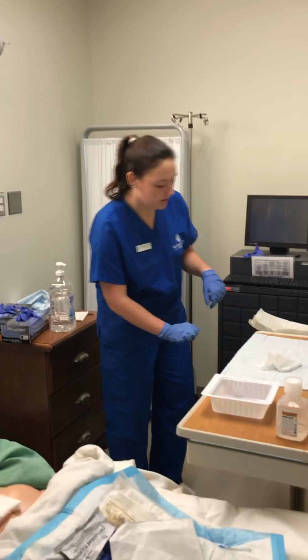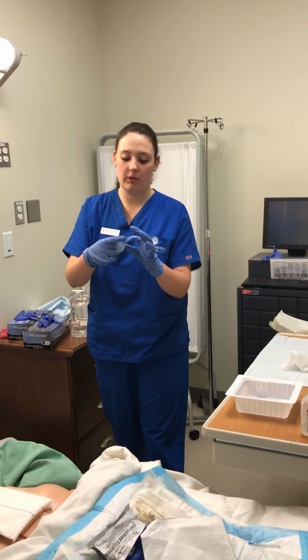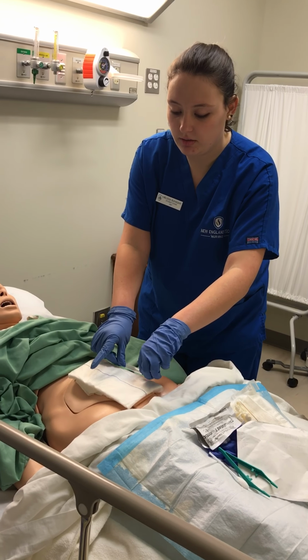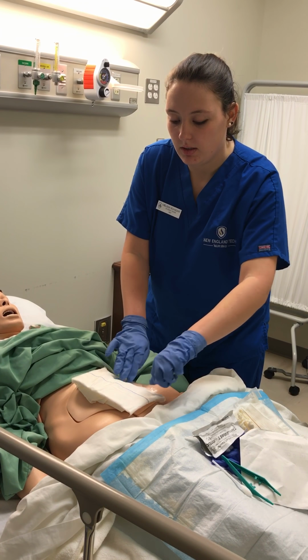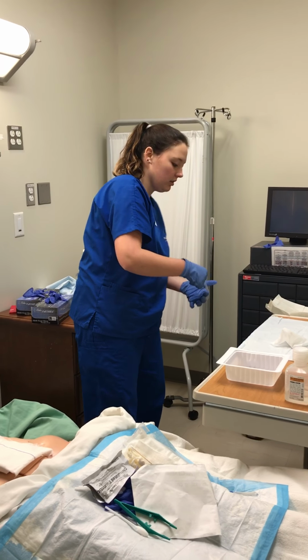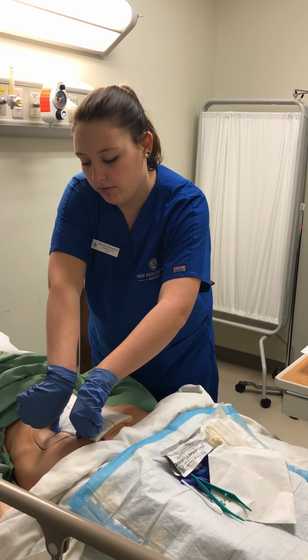Now I'm going to tape. The sterile part of the procedure is over, so it's okay for me to go outside my sterile field. Really, I could take off my gloves if I preferred, but they're keeping me warm right now. You want to tape all 4 edges.